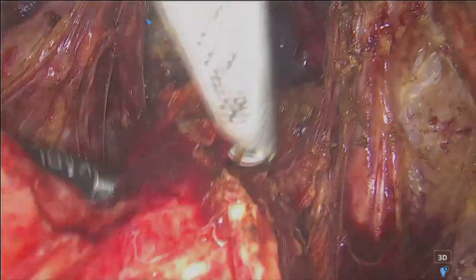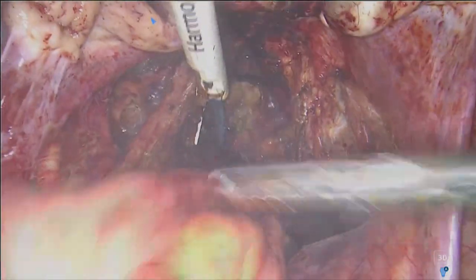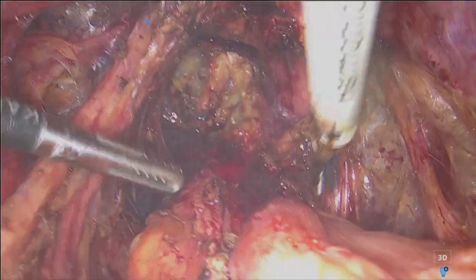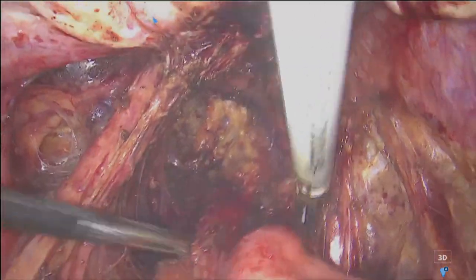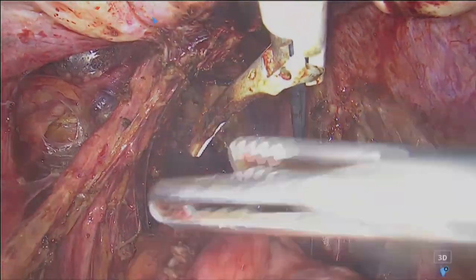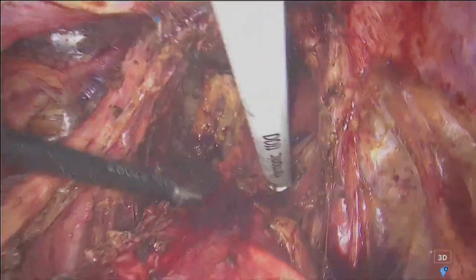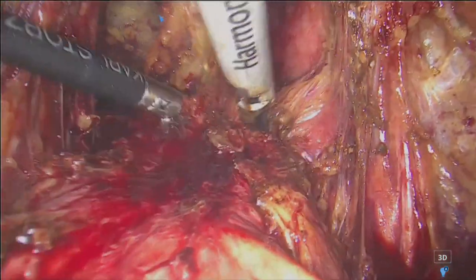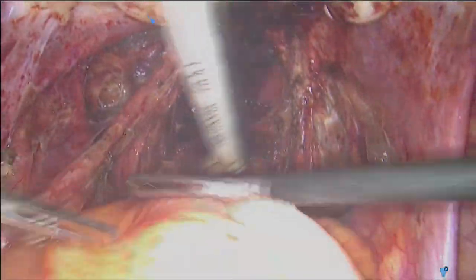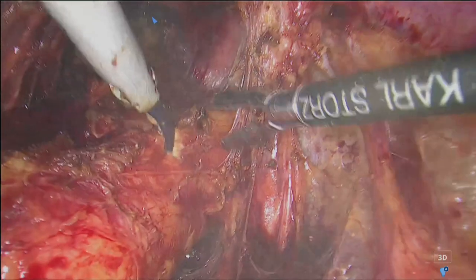So I can feel the nodule, big, very big. You know, the preoperative ultrasound evaluation is very important, because sometimes it's impossible during the surgery to understand how big and how deep the nodule is. So it's mandatory to do a good preoperative ultrasound evaluation. And I feel the nodule here and it stops here. So I have to cut over there, and to cut the rectum there, I start the preparation laterally here.